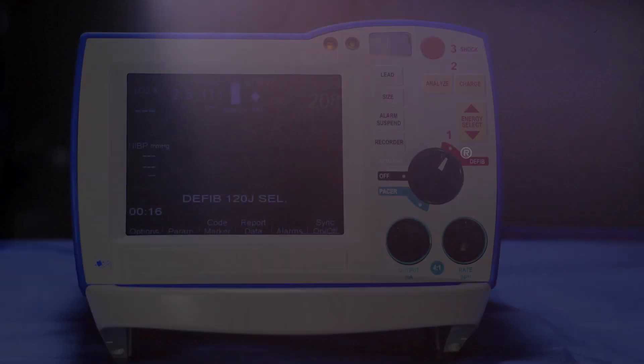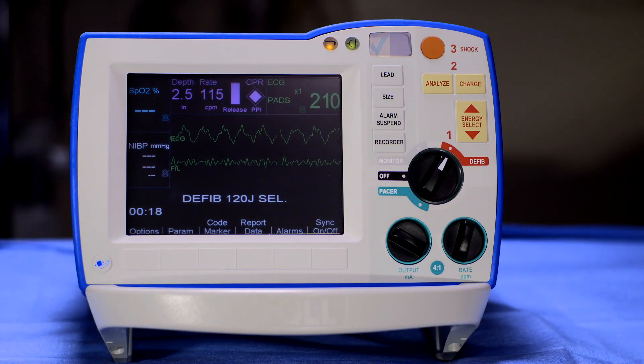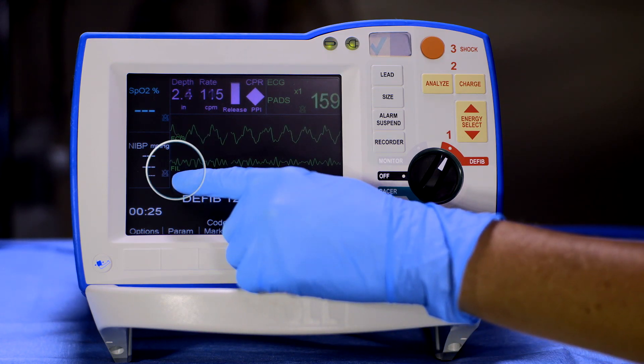The See-Through CPR feature of the R-Series filters compression artifact from the ECG waveform. This results in a filtered ECG waveform labeled as FIL.